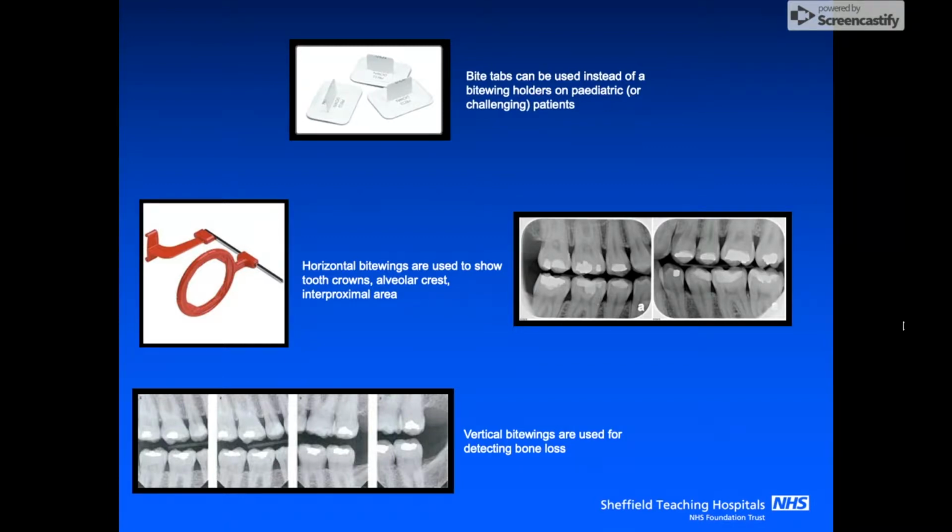The posterior teeth and the image receptor should be in contact or as close together as possible. The holder is inserted carefully into the lingual sulcus opposite the posterior teeth. The anterior edge of the image receptor should be positioned opposite to the distal aspect of the lower canine.